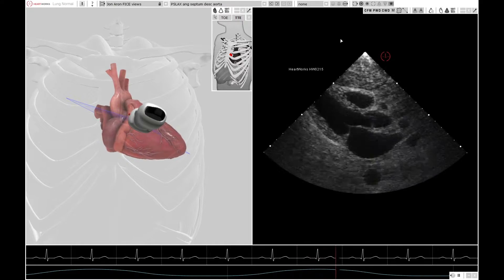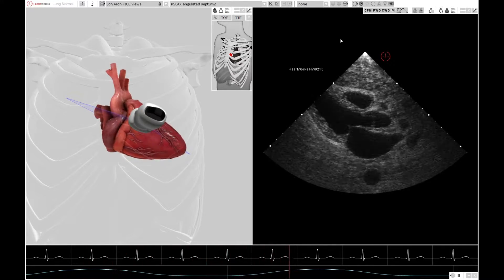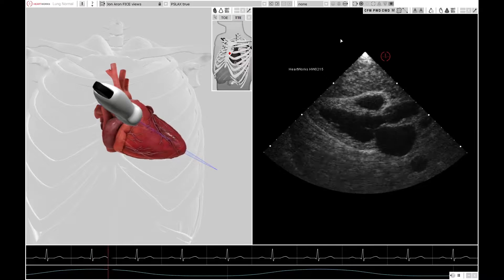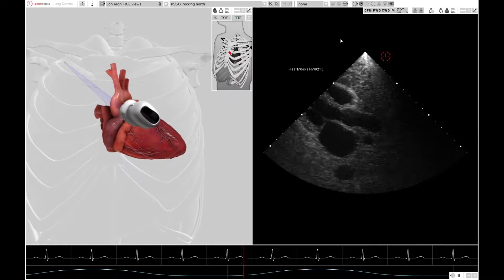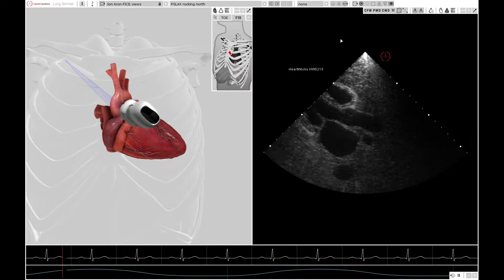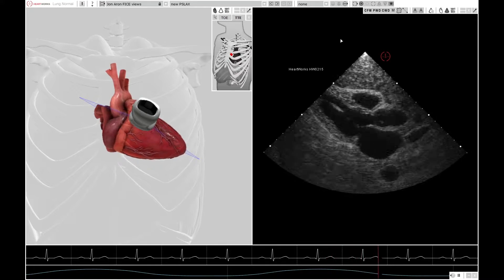This is a very good parasternal long axis view, with the apex not being visualised. By rocking the probe — a movement along its long axis — you can see more of the apex, or if you rock it the other way, you can see more of the aortic root. The standard FICE view is as shown before, with the aortic valve and mitral valve in the centre and the apex not visible.